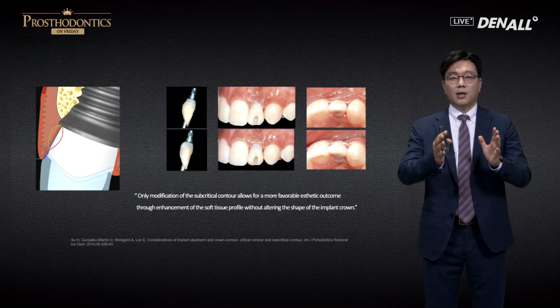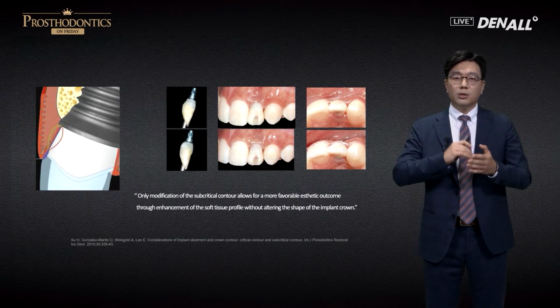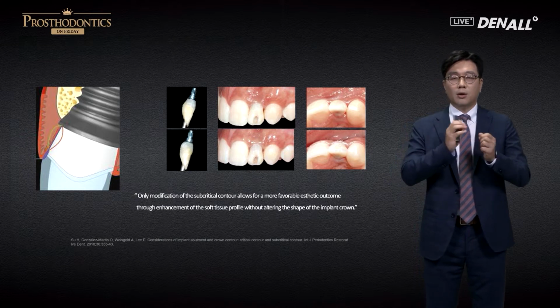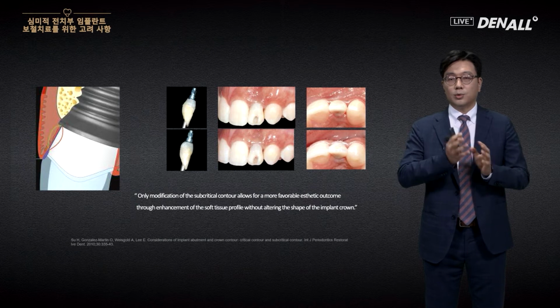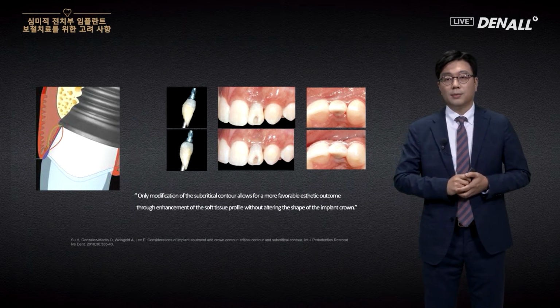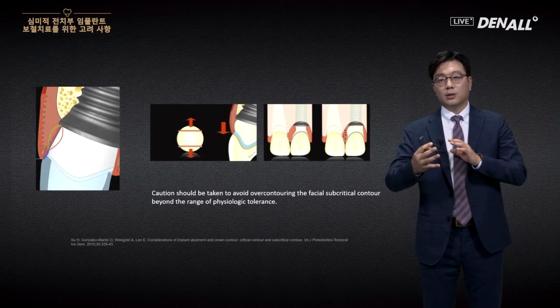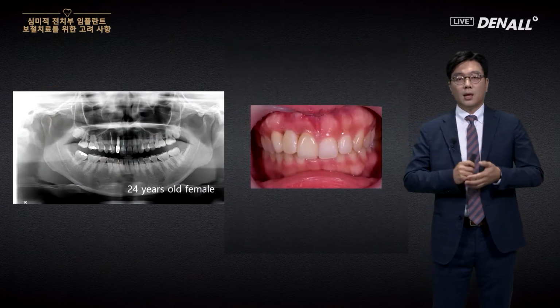The existing form is okay. If the gingiva is receded for prosthesis, a temporary abutment can be adjusted. Provisional restoration can be adjusted to control the contour. The receded portion can be pushed out on the subgingival level. Let's look at a case.